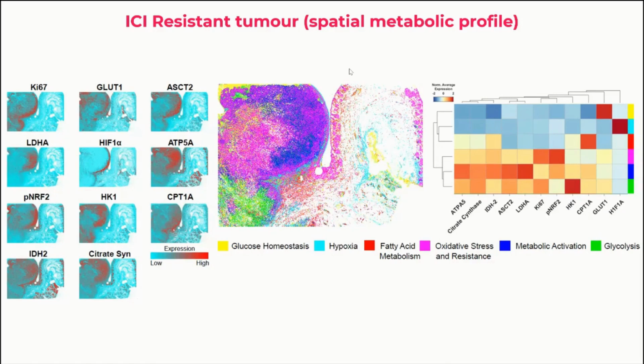And so by the same token, we can start to identify on diagnostic tissues or early surgical specimens what a pathological complete response looks like, but also what progressive disease looks like. Can we start to identify minimal signatures that define these patient groups? And can we then identify it early in the piece so that these become predictive biomarkers? So really moving these assays into the companion diagnostic space.